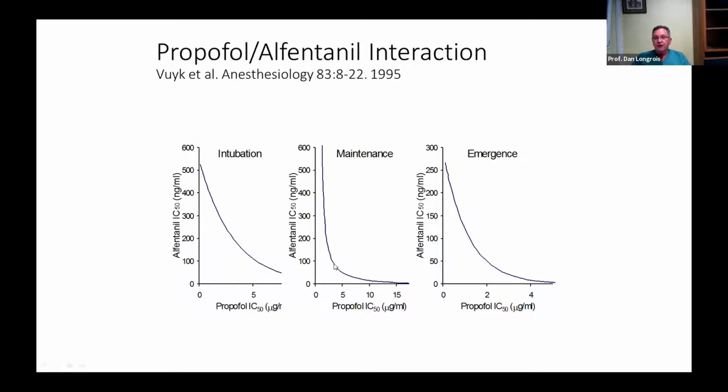So whatever information you can derive during the induction phase, so let's say you titrate the opioid to avoid an increase in the EEG activation and the lack of increase in the BIS value, it doesn't apply to the maintenance. So basically the use of the monitors cannot be limited to the induction, but it has to do with the maintenance. And the emergence is slightly different, but we already know this.